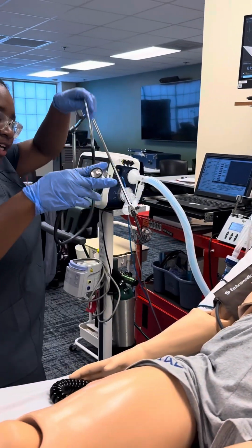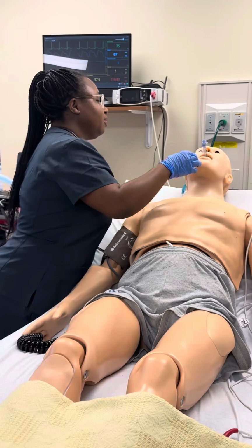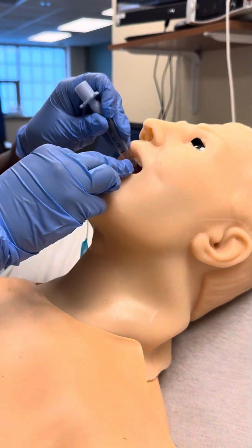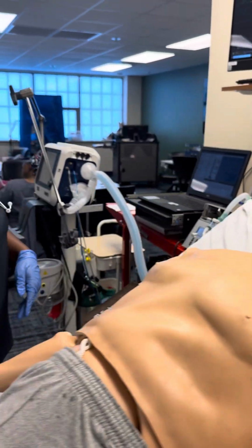Okay, patient has equal bilateral breath sounds. I'm going to check the tube placement, which it looks like 26 at the lip and 27 at the teeth.